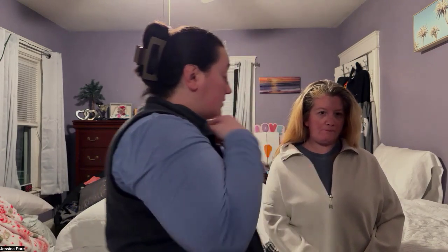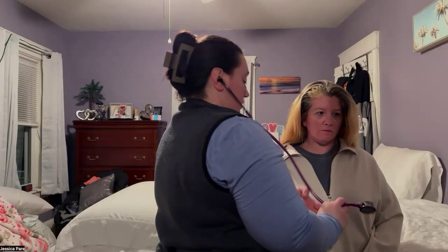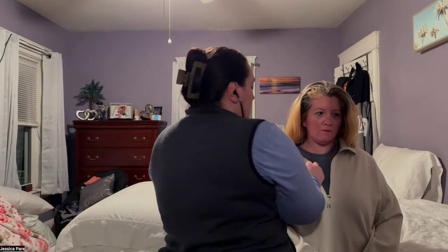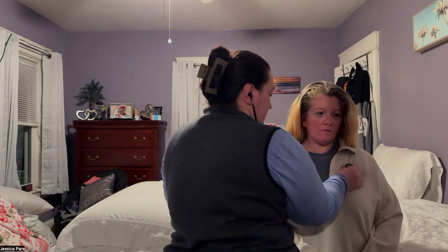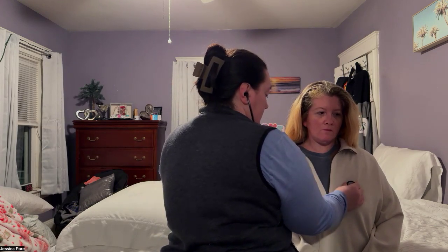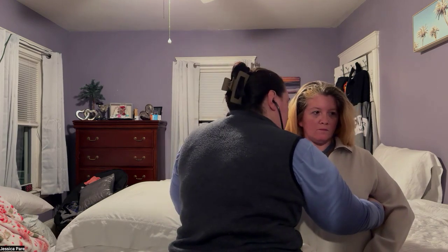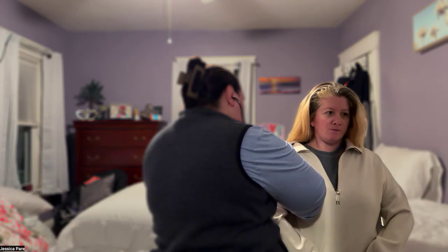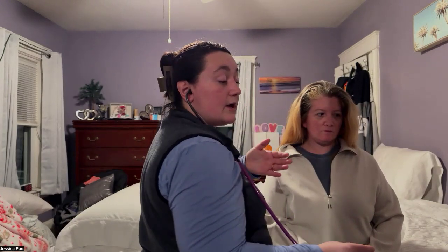I then am going to auscultate her lung sounds anteriorly. Okay, take a deep breath for me. Perfect. One more. One more. Good. Lung sounds appear clear, with no adventitious lung sounds noted.